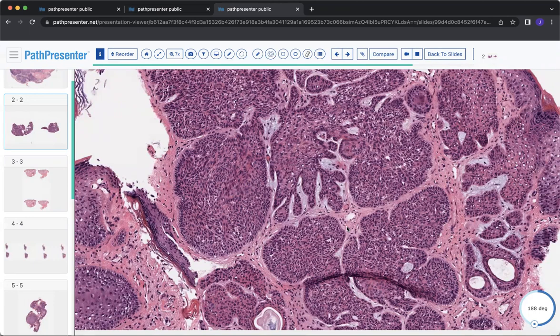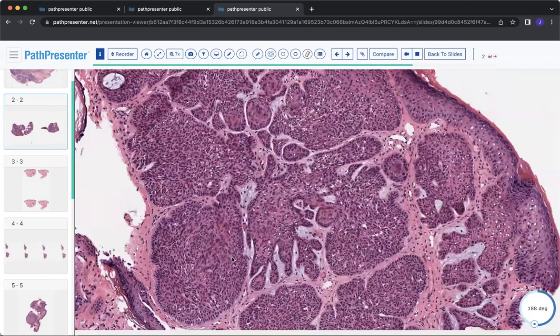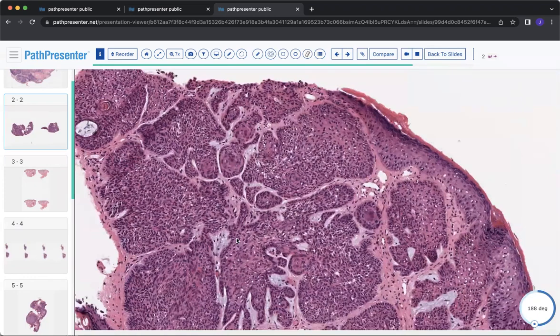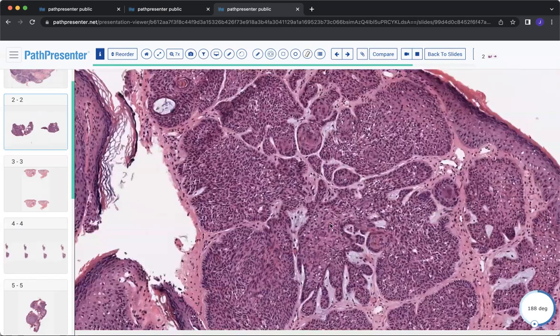However, immunohistochemistry can definitely help you separate out statistically whether or not you're dealing with a trichoepithelioma or a basal cell carcinoma. So I like to get a BerEP4 just to show that it's positive, although you're going to expect to see that in both a trichoepithelioma and a basal cell carcinoma. So BerEP4 doesn't necessarily help you, but it can help you in the sense to highlight both trichoepithelioma or basal cell carcinoma, and it will not often stain other tricho entities such as trichilemmoma. So BerEP4 should be positive.